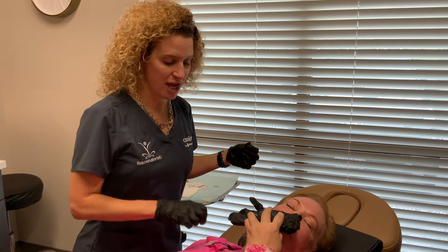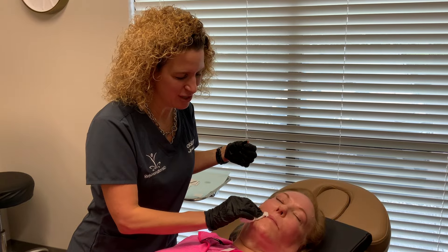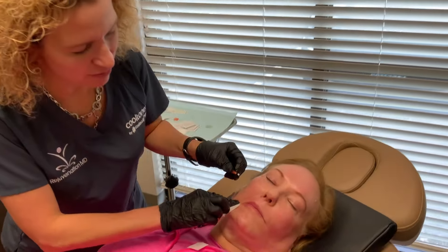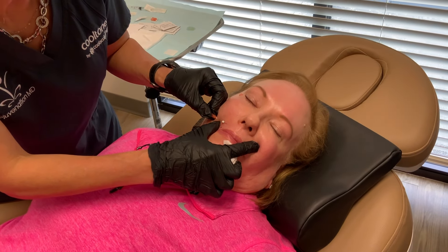I do have some people that like to do it every time they come in for Botox — they do a little bit above their upper lip with these PDO threads. The entire time they're in there, which is about a year since it takes a year to dissolve, they will be making you produce collagen. So we love more collagen.